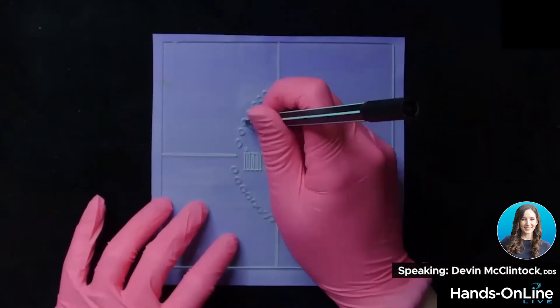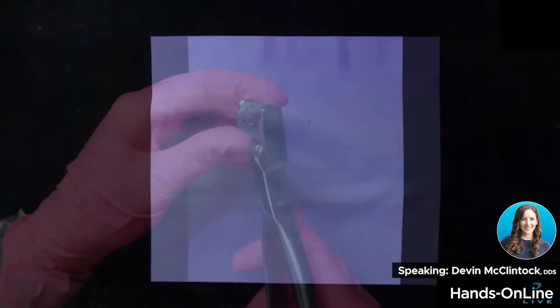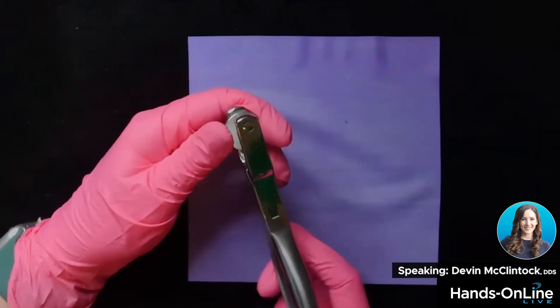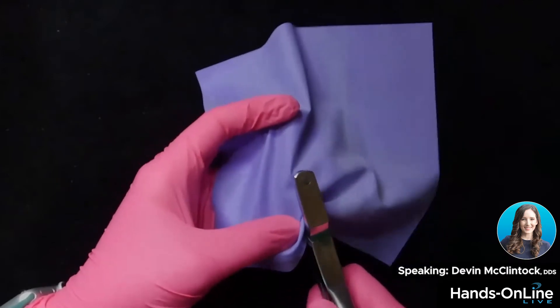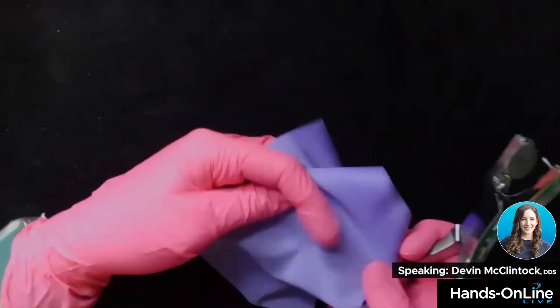You can just take a pen. I like to just do the first molars — you just do two quick dots. The different size holes mean different things. For this one, you're going to go with the largest one because that's where you use your clamps, and you really want a good punch that goes right through so that you don't have a little piece hanging out.